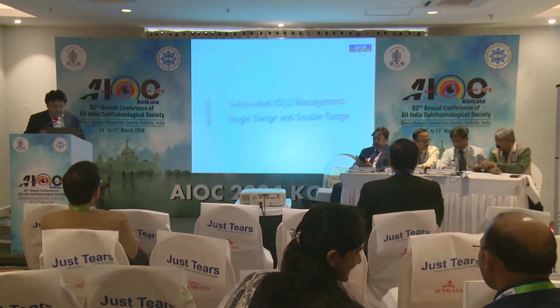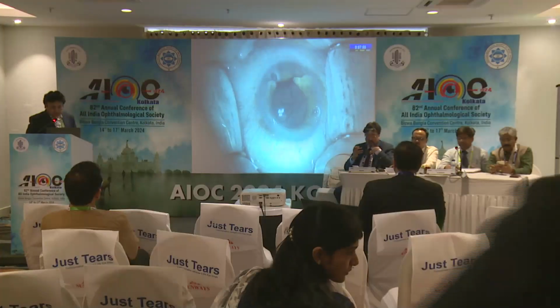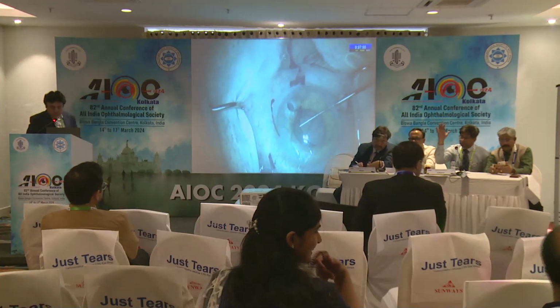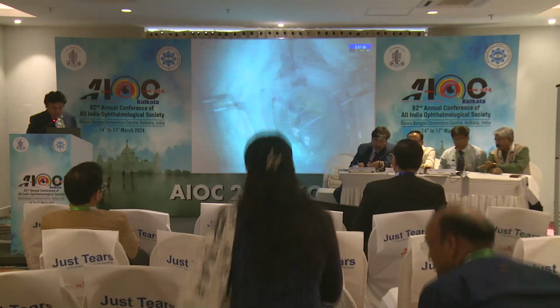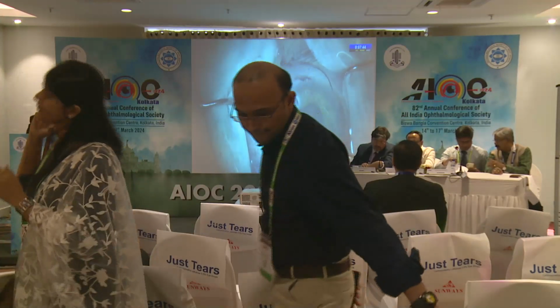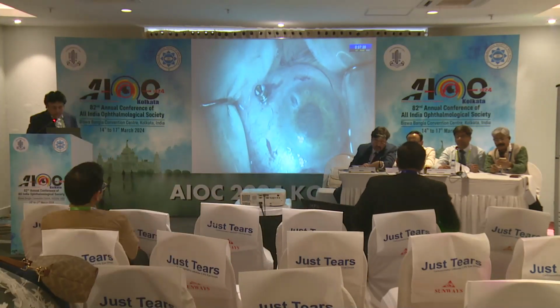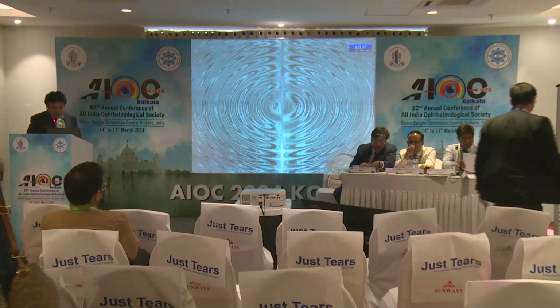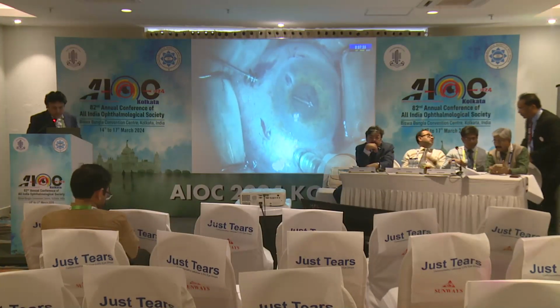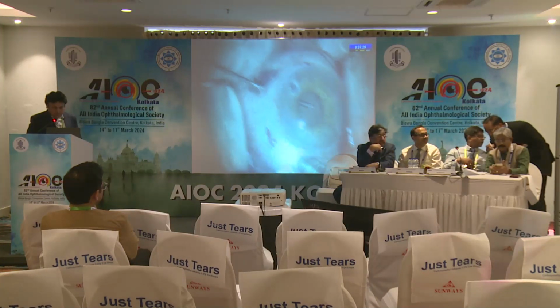Subluxated IOLs appear commonly in practice, with IOL implant surgery becoming so popular and easily available. Techniques practiced so far involve the removal of the lenses and exchange with another intraocular lens, either iris claw lens or scleral fixated. This video will demonstrate techniques to refixate the same subluxated lens by the usage of flanges.